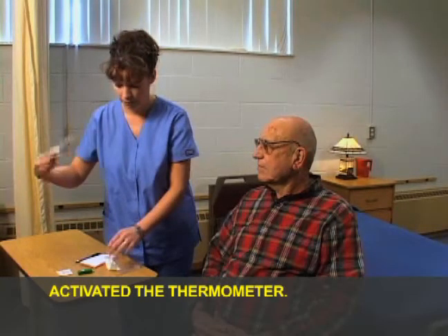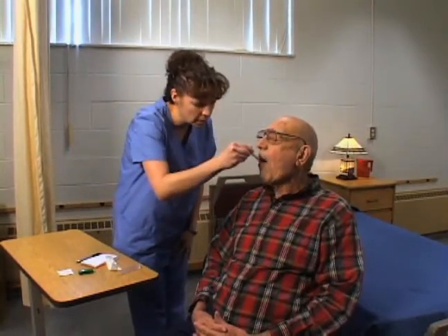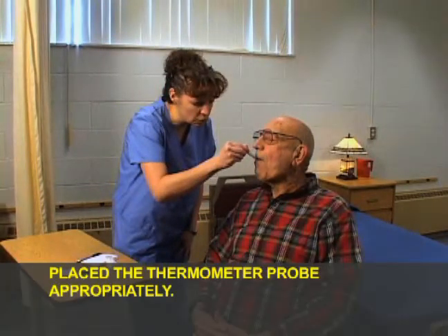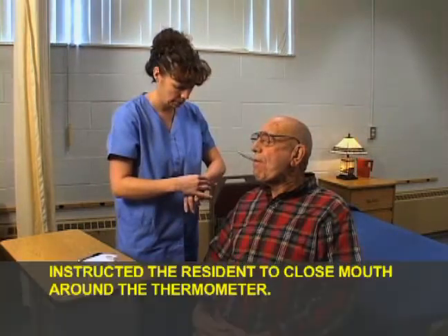Activated the thermometer. Covered thermometer as appropriate. Place the thermometer probe appropriately. Instructed the resident to close mouth around the thermometer.